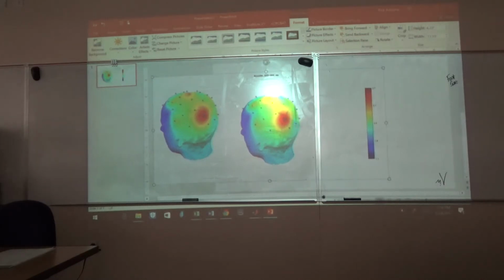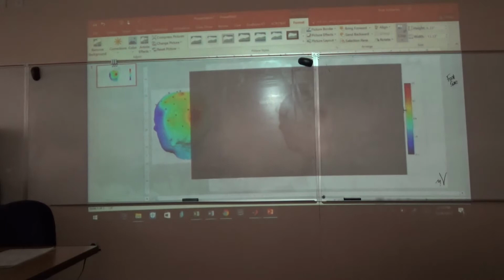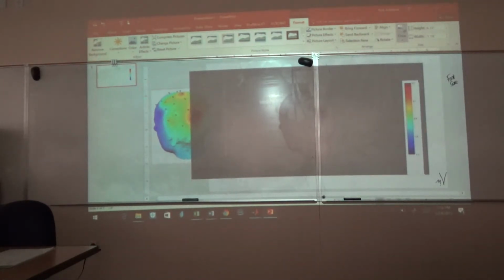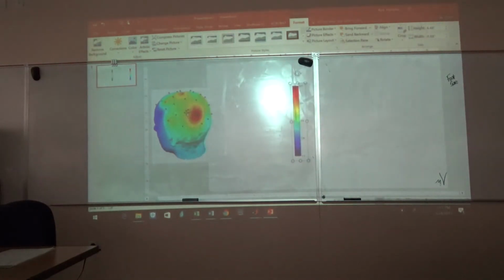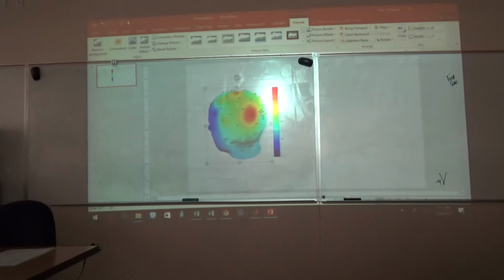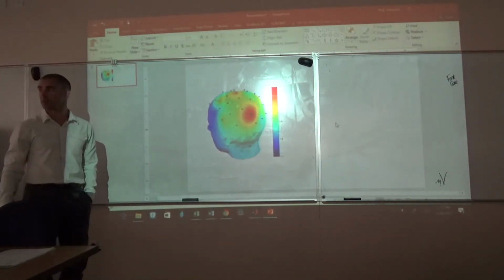And now we're going to do the same thing for this other big file. Double click on that, hit crop, and this time we're going to block out the whole head and we're just going to grab our scale bar. In fact, you can make it nice and tight right around it. So now what you've done is you've made it very manageable. Isn't that nice? Really easy, right?